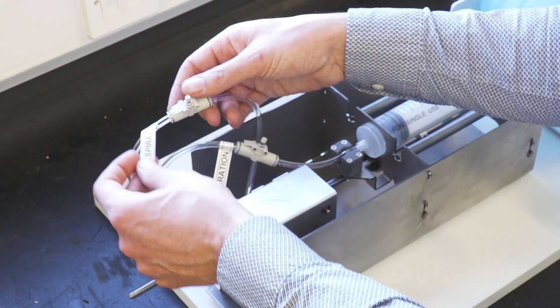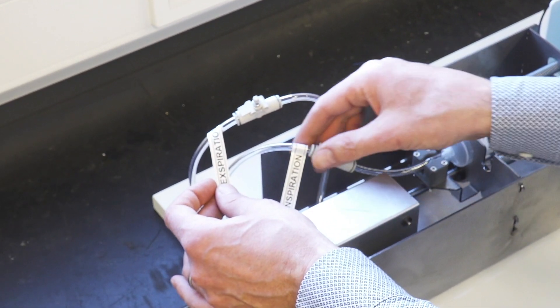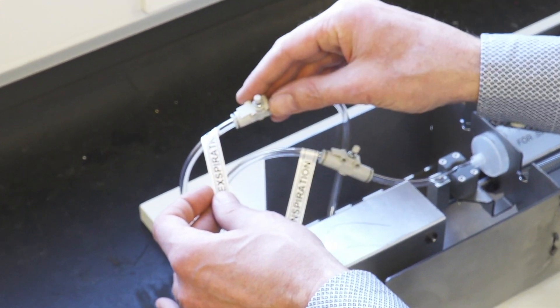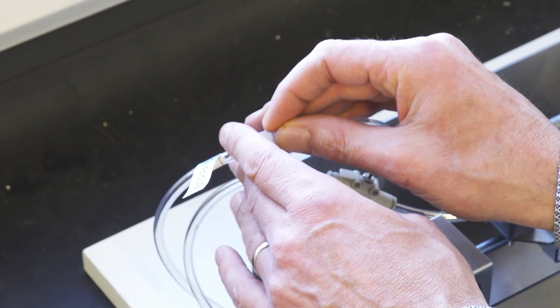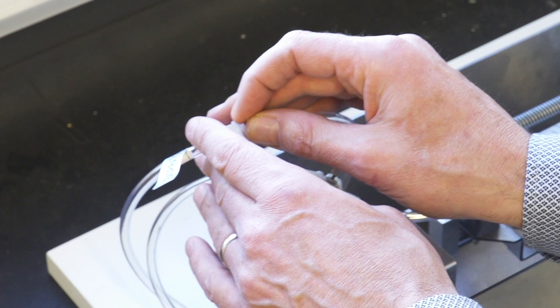So these two controls are for the breath in and the breath out. They can each be set individually, so for instance if you want it to cycle a bit faster we can increase the expiration.